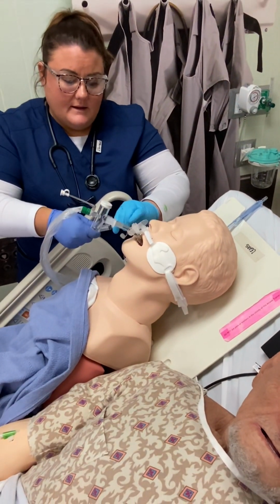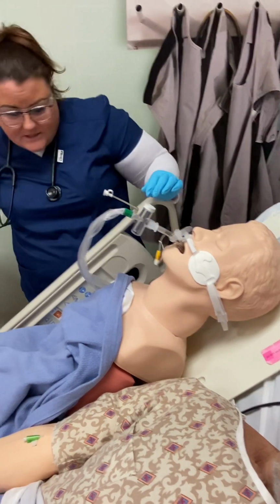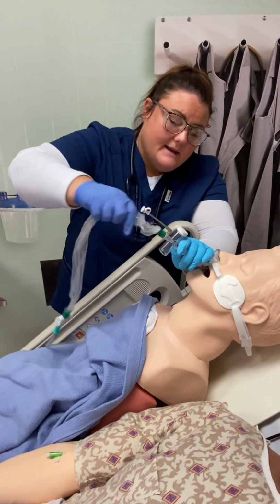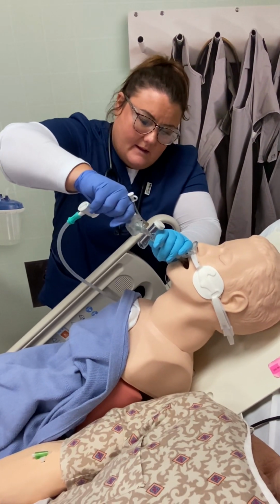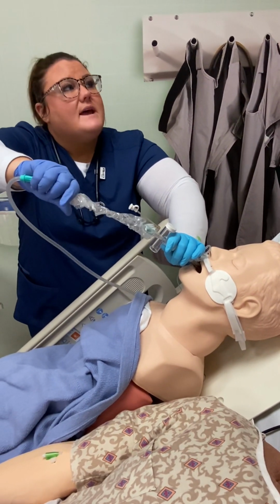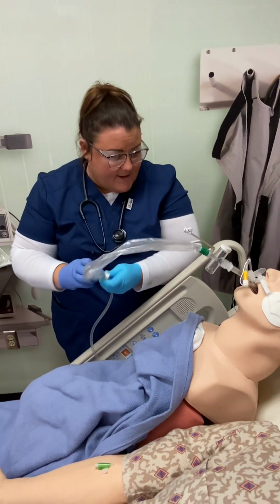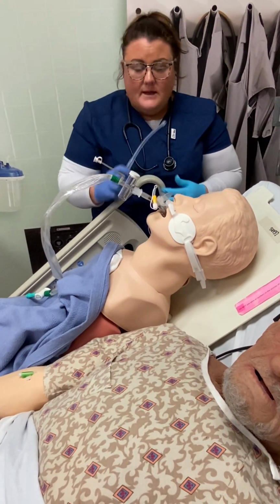Okay. All right, Mr. Smith. I'm about to suction you out, okay? So I would unlock this. All right, we ready? Cough, okay? And until I meet resistance, and then I'm gonna pull back 2 to 3 centimeters. I'm checking my heart rate, my respiration rate, my blood pressure, my SpO2, and my EKG. Okay, we're gonna lock that back. And then I would grab my Yonker.